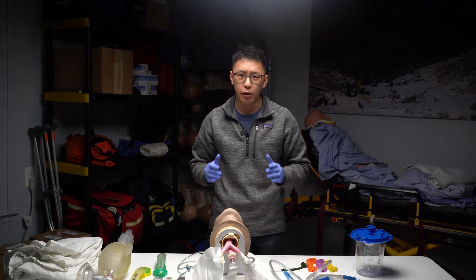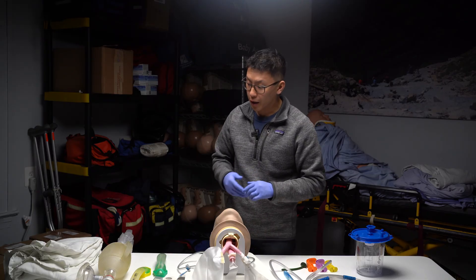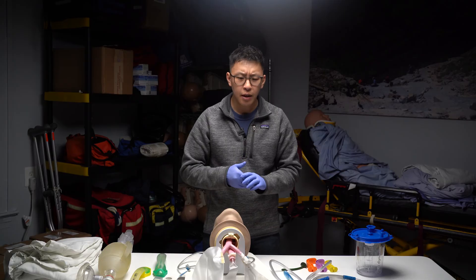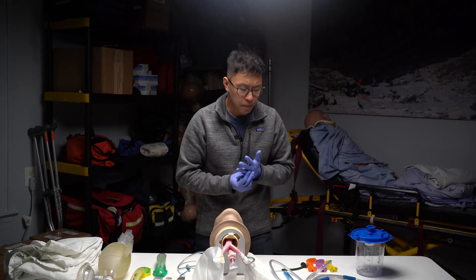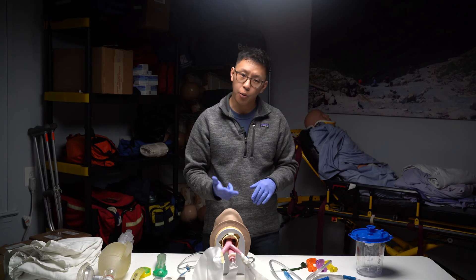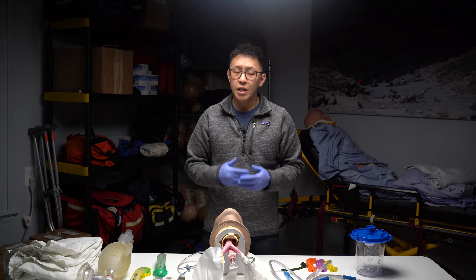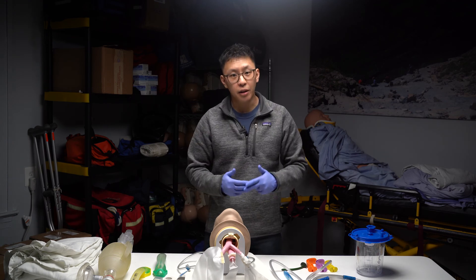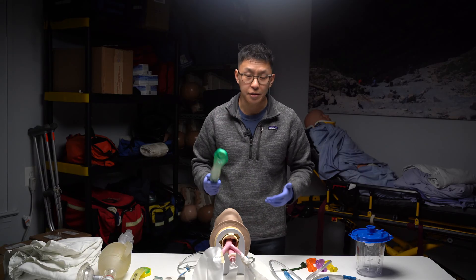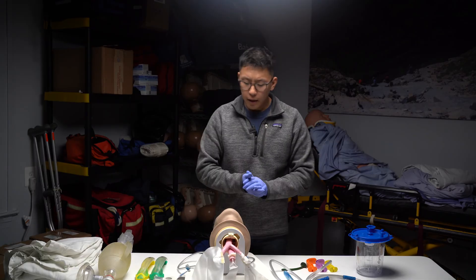Hey, what's going on everyone? Victor here with Airway Management. I wanted to update this video because the audio was awful on the last one. We're also updating our airway management to include ramping. I'm going to go from beginning to end and explain things along the way. Out of the three scenarios in our Unit 2 exam — respiratory, cardiac, and airway — airway management is typically the easiest because that scenario can't change.